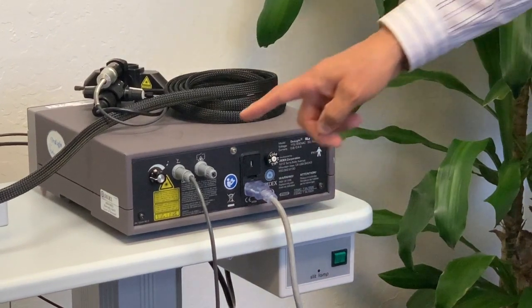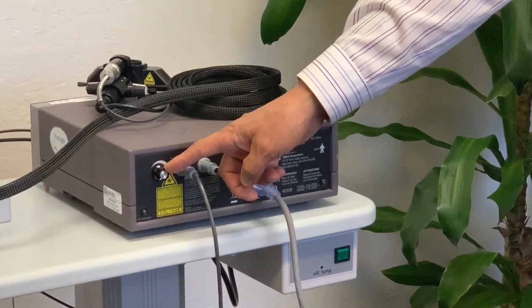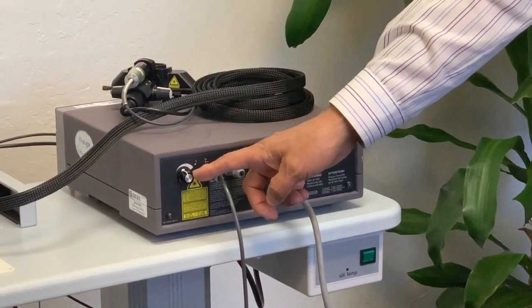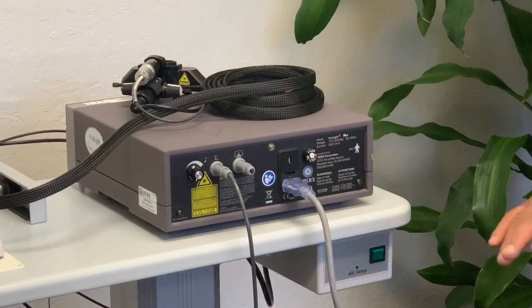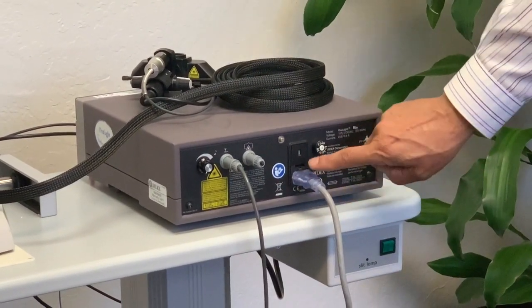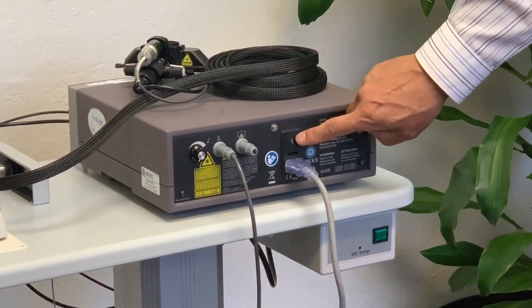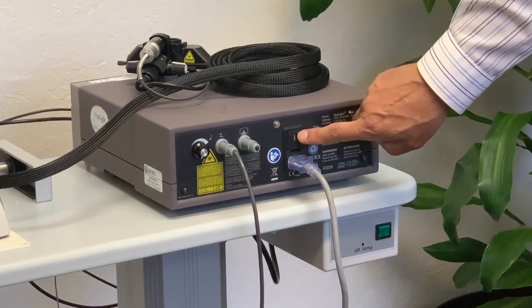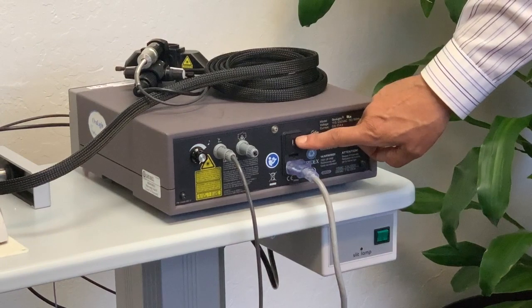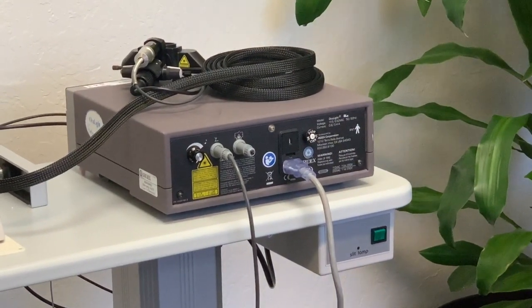There is also a volume control here for the beeping of the laser. You can increase and decrease the volume by turning this knob back and forth. One also has to be careful that the laser is set for 115 or 240 volts. From this small window, you can see whether the laser is set up for 240 international or 115 domestic, where the voltage is different.